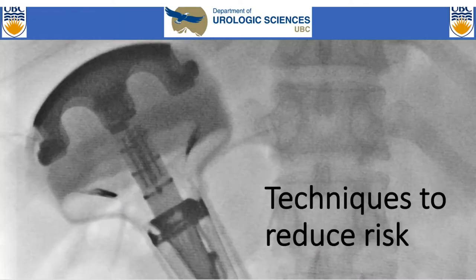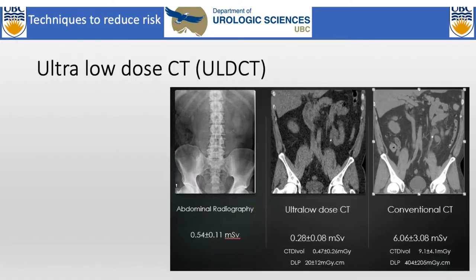So, what can we do to reduce risk? This is a study that Dr. Chu and Moore are involved in looking at, so not just low-dose CT, but ultra-low-dose CT. They looked at 83 patients with a total of 230 stones coming in for SWL. What they did was perform an abdominal radiograph as well as an ultra-low-dose CT, and then looked at technical parameters around the two.